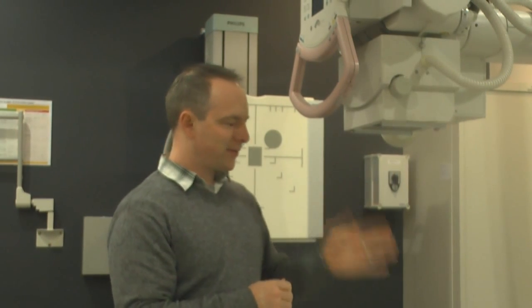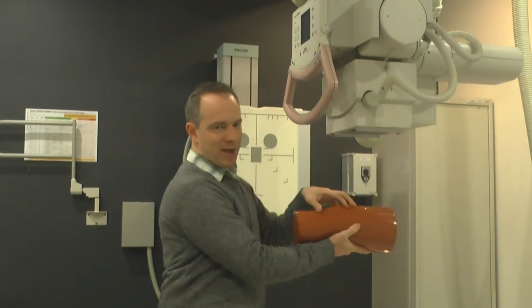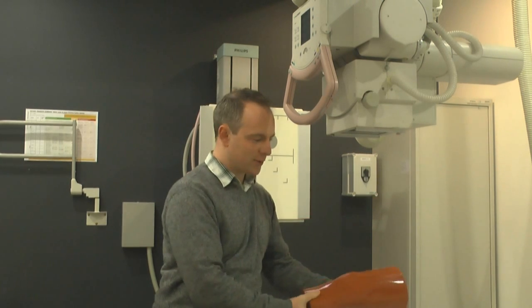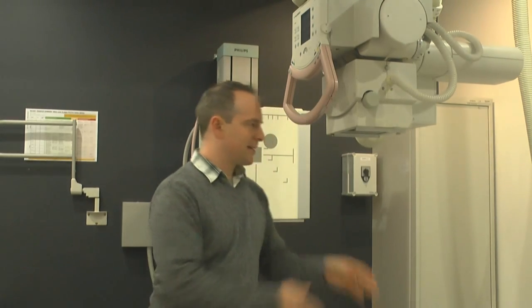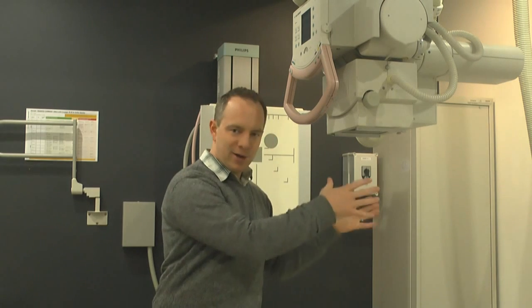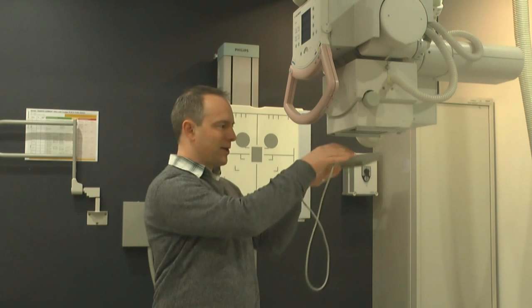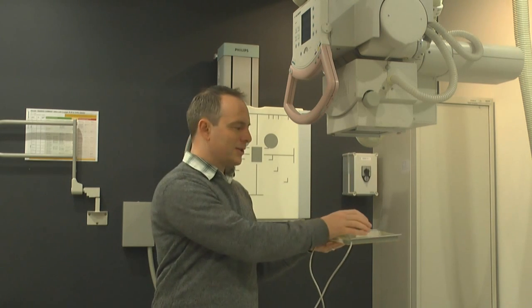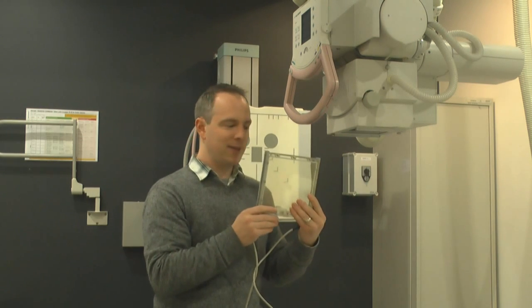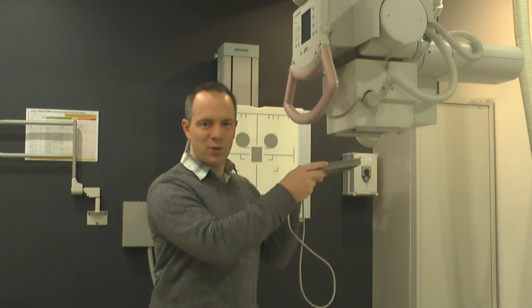So in other words, if I have my tissue in here, the amount of ionizing radiation, the amount of energy deposited per unit mass, is going to be reduced the further I get away from the source. But really what's happening is that the number of X-rays are not reducing as we get further away from the source, because the area of the beam is also increasing. So the dose area product meter measures a reduction in dose as we get further away, but because the beam is expanding in size, as long as the beam still fits within the field of view of the DAP meter, then that product remains constant. So it is independent of source to object distance.